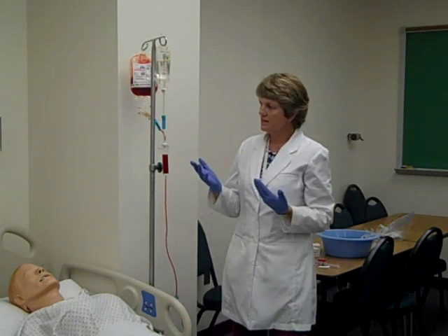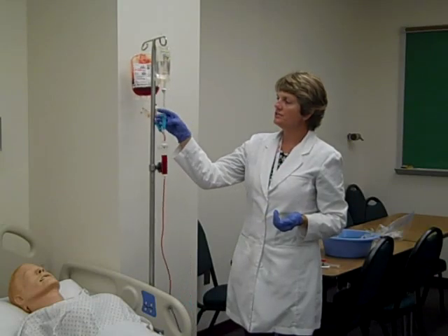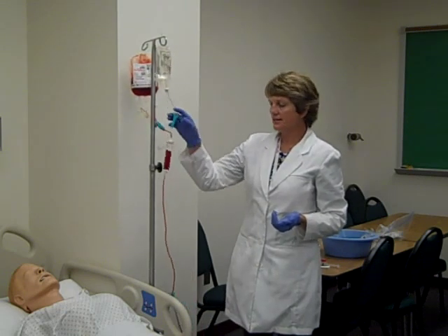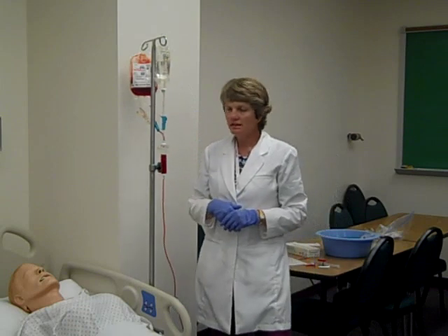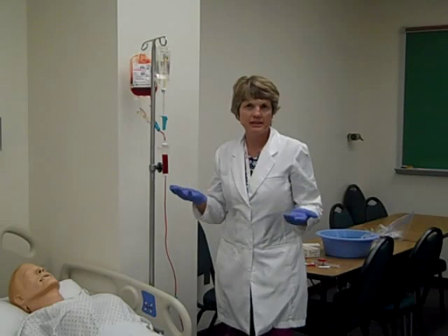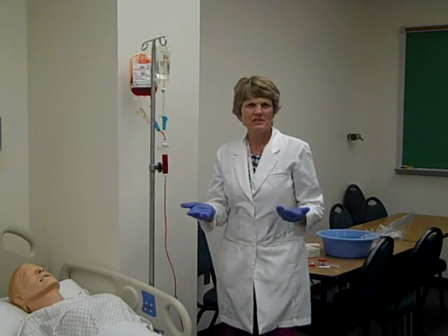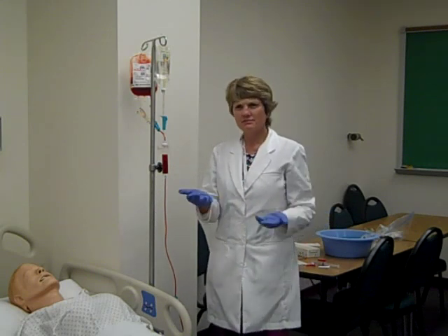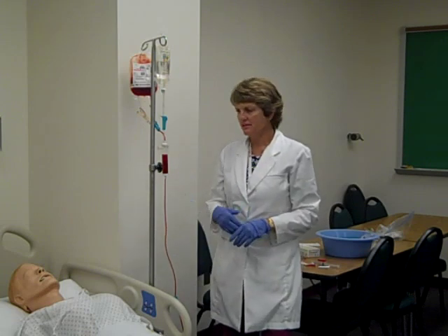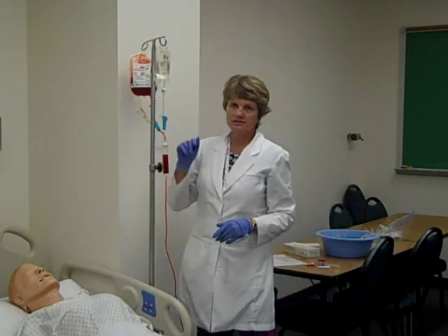And when the blood is done, I'm going to close the clamp, the Y side of my blood unit. I'm going to open the clamp of the saline, the Y side that's running to my saline, and I want to infuse it. You can infuse it at a rate that perhaps the blood was running at, 100 cc's an hour, and infuse about 50 cc's, which would put about 50 cc's of normal saline in over a half an hour, just enough to clear that line, because there's a lot of residual blood cells in that line even after the transfusion bag is empty.